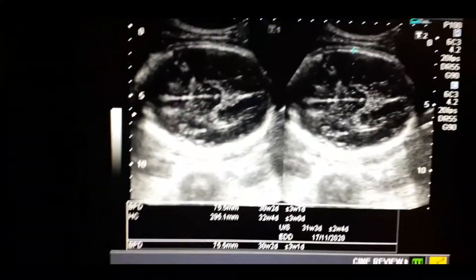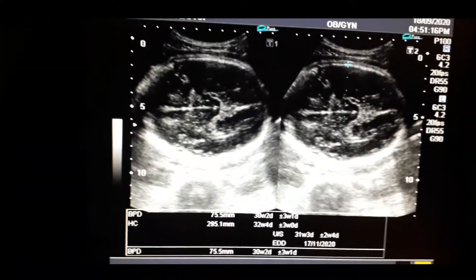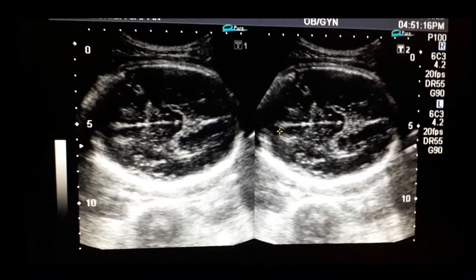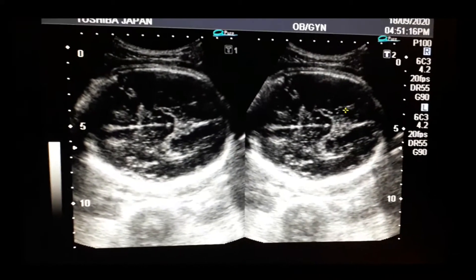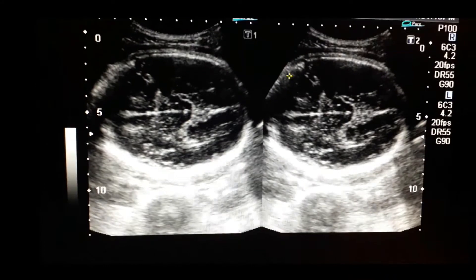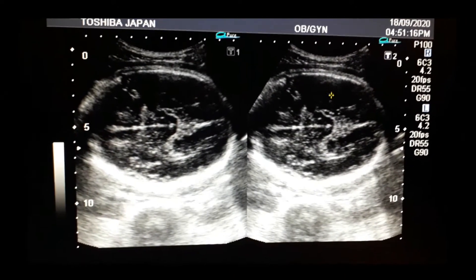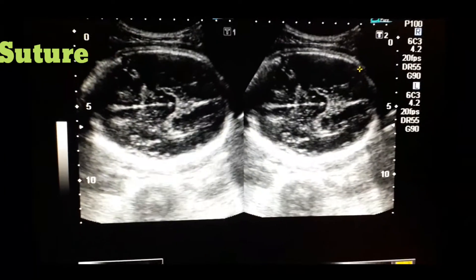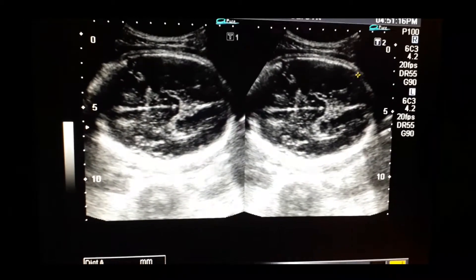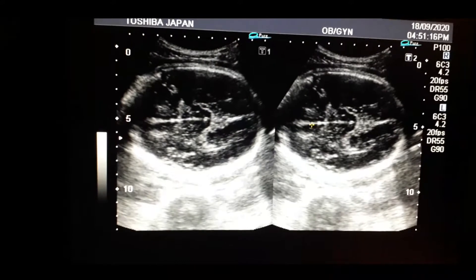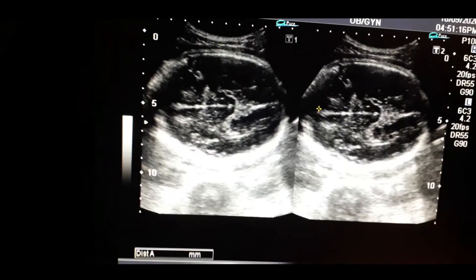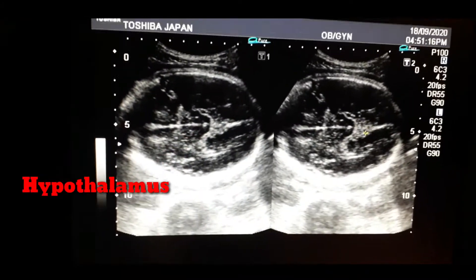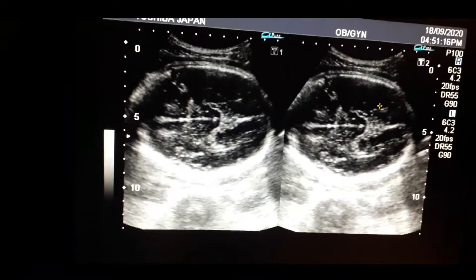After taking this biparietal diameter, we have to consider what structures should not be seen in this section. There should not be any ossification of the sutures. The bone should be complete and lateral ventricles should not be seen in this section. The thalamus should be visible and there should not be any cerebellum in this section.